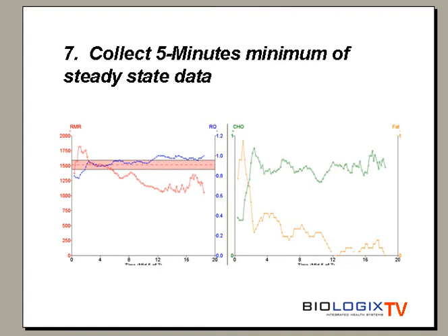As you can see, this assessment was a difficult one to work with. However, minutes 12 to 17 give us as close to a horizontal line steady state as possible.